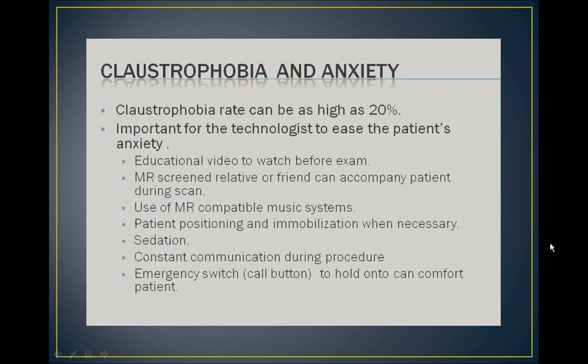In addition, every patient is given the emergency call button. Anxiety may be instantly decreased because they know that the alarm will ring, which will enable a technologist to move quickly and remove the patient from the scanner if they desire. This must be explained to them so that they know what will happen if they choose to use the call button.